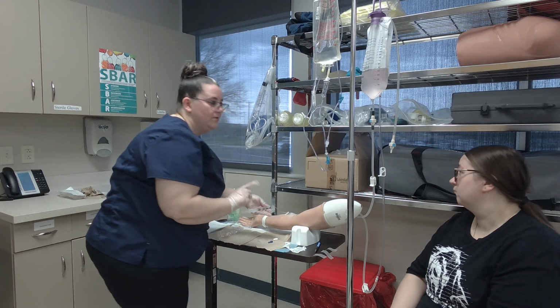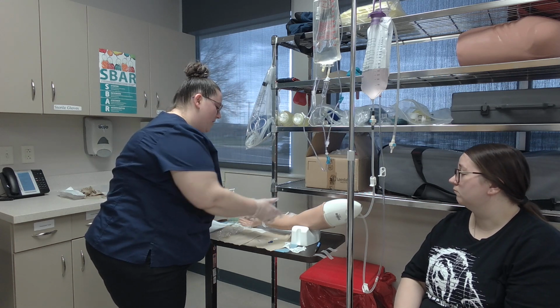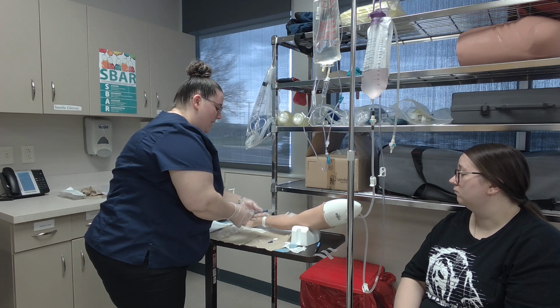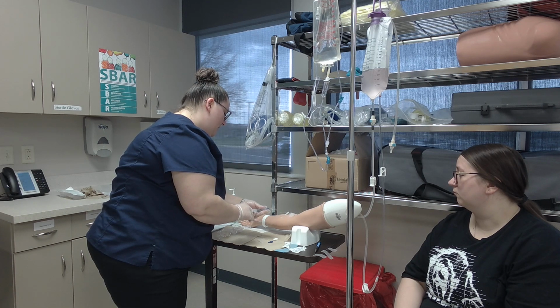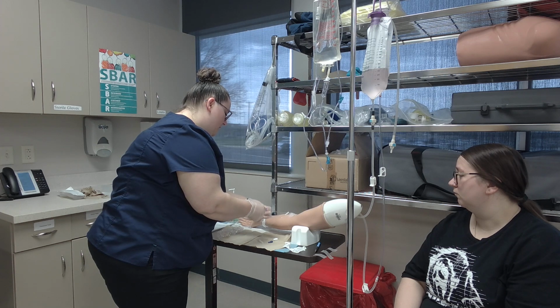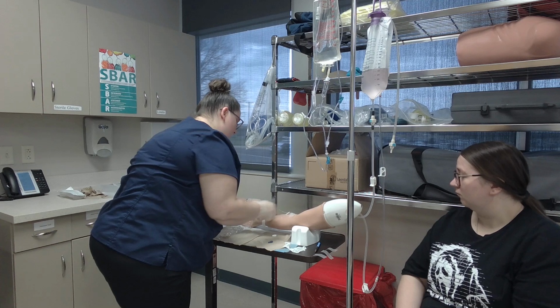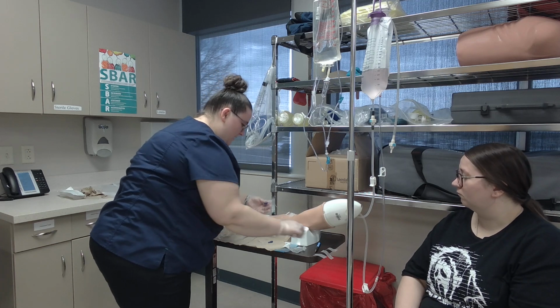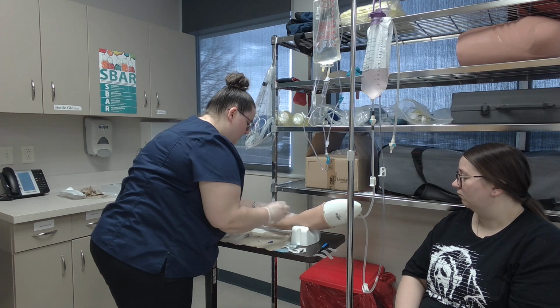Actually, before I do that, I would pull back and check for any blood return, and then I would do the push pause method and put my 3 ml in. And when that is all in with the push pause method, I'm going to take this off. Actually, I'm going to clamp. Then I'm going to take this off and do my second 30-second scrub here.